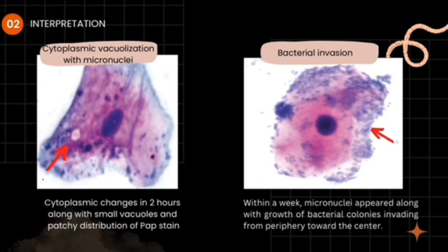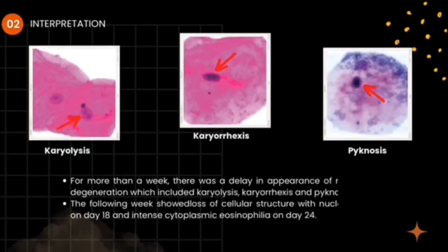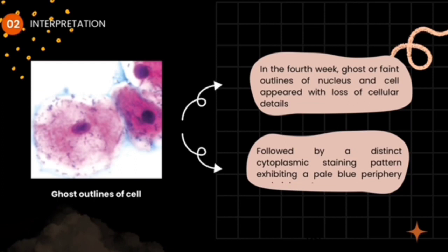As I attached the picture, it indicated that the cytoplasm was changing, with small vacuoles and a patchy distribution of pap stains. Within a week, micronuclei appeared, along with growth of bacterial colonies, invading from the periphery toward the center. Next, there was a delay in the appearance of nuclear signs of degeneration for more than a week. These included karyolysis, karyorrhexis, and pyknosis. In the fourth week, ghost outlines of the nucleus and cell appeared with loss of cellular features.